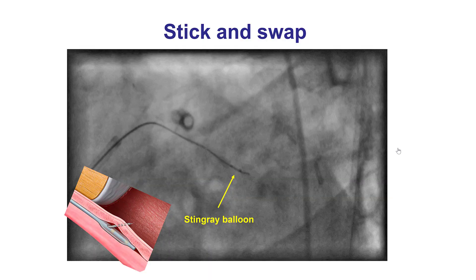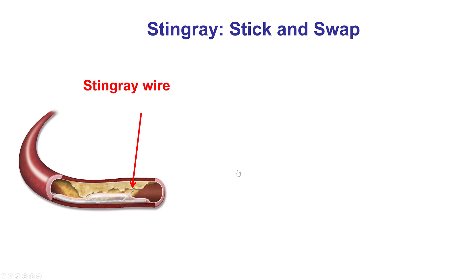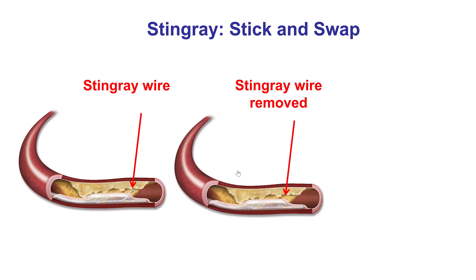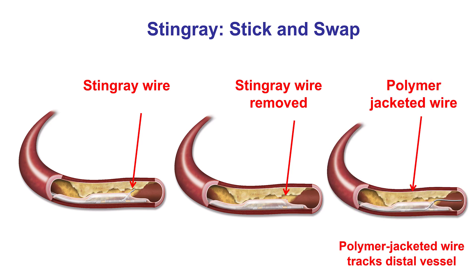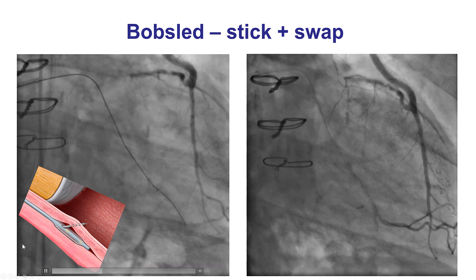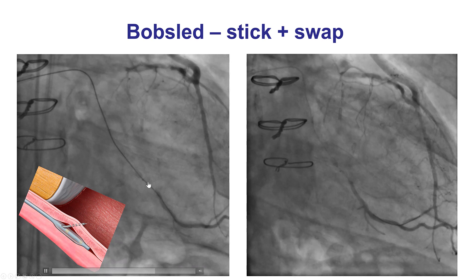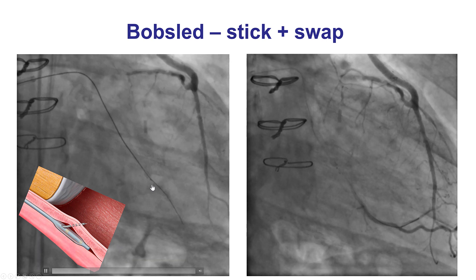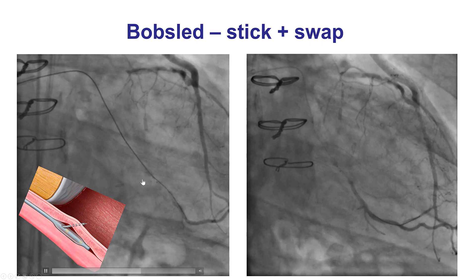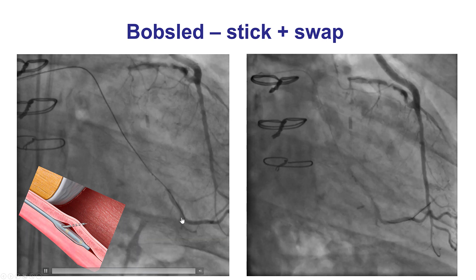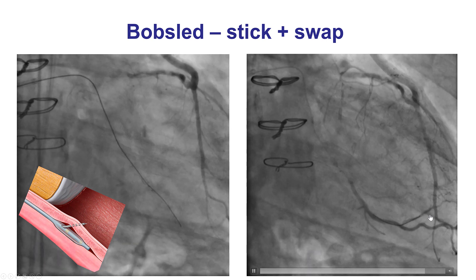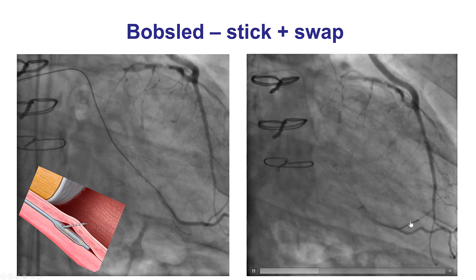This was done using the stick-and-swap technique. A Stingray balloon was delivered distal to the distal cap, and then we performed the stick with a Stingray wire, which creates a fenestration into the true lumen. We then used a Pilot 200 to wire the distal true lumen successfully. The Stingray balloon exit point toward the true lumen is actually proximal to the proximal marker, and the Pilot 200 guide wire on two projections is confirmed into the distal true lumen.